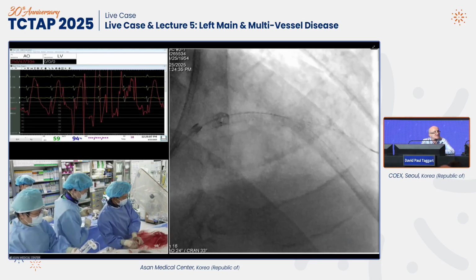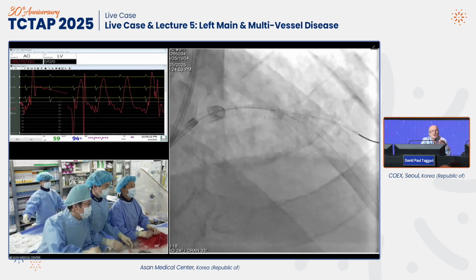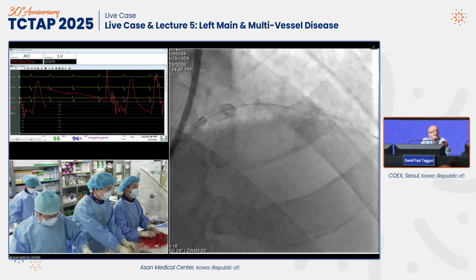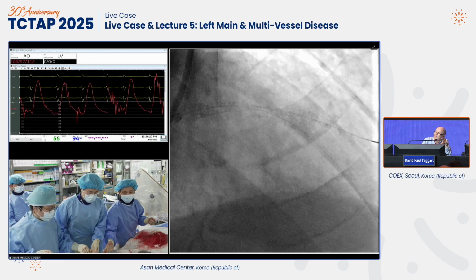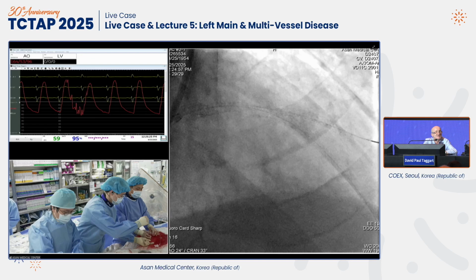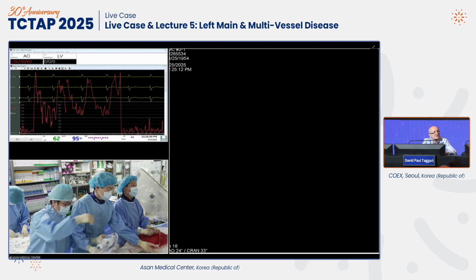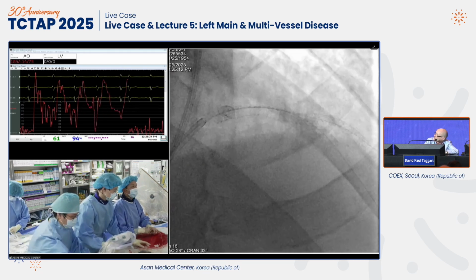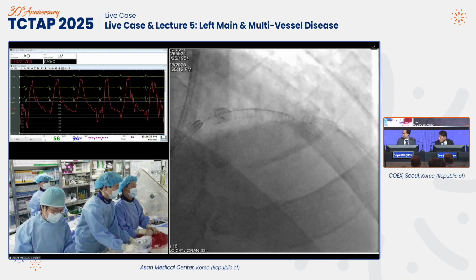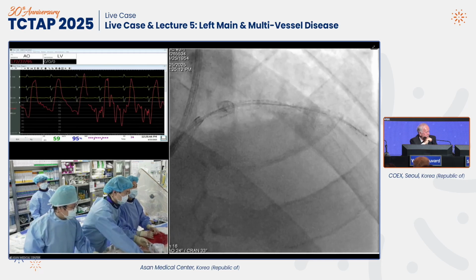What many patients are looking for are long-term outcomes if they are low risk for an operation. So this looks a superb result. I often see this, but I also see the patients who come back whose initial early result didn't stand the test of time. So we have the 10 years SYNTAX results, without difference. Maybe wait 20 years to see.